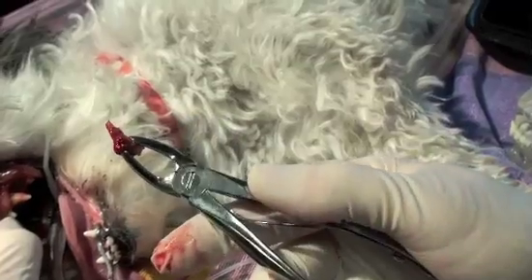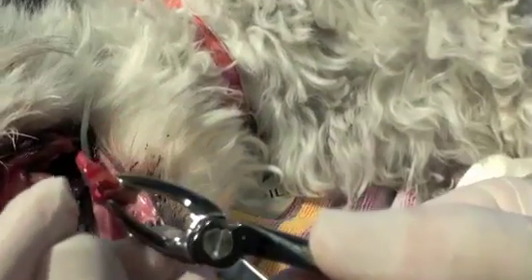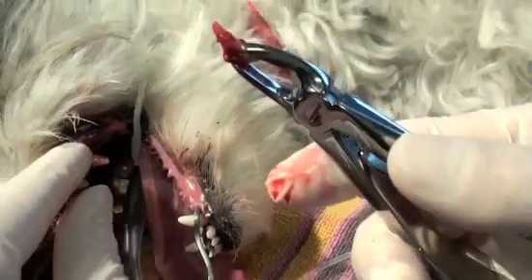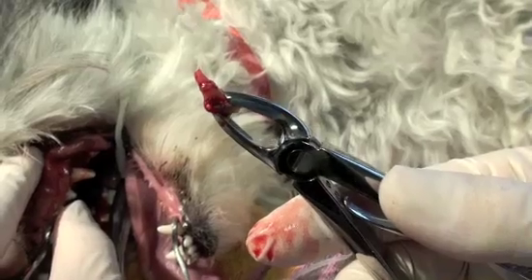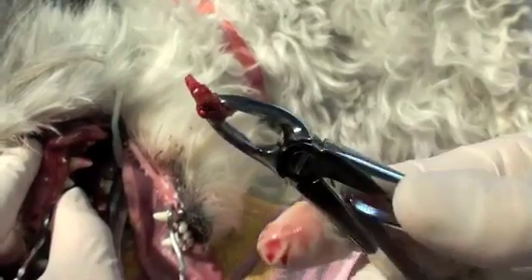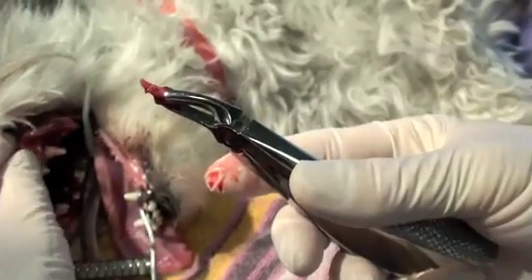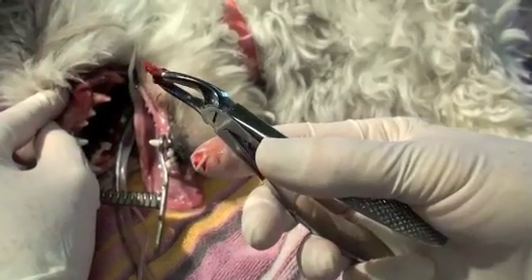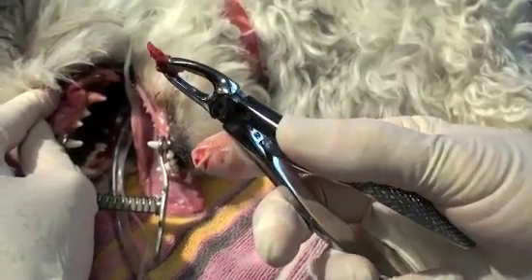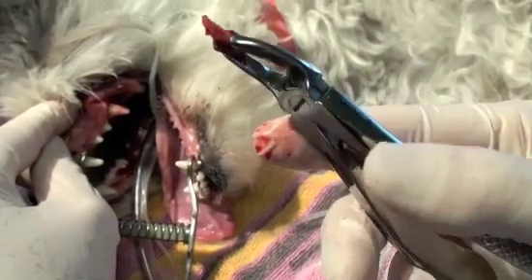So the importance is to try and get the entire root of the tooth, not just if we manage to fracture that little tooth root off at the bottom, this dog could have a draining sinus tract or an abscess of that root tooth long term. So it's critical to get rid of that. And in a 3-root tooth like this upper carnassial, you need to section the tooth into 2 or potentially 3 and remove all 3 roots individually. But that's come out really nicely in this little man.